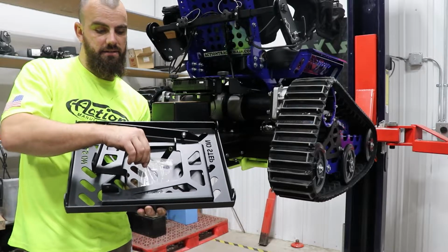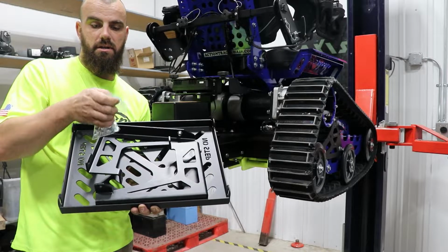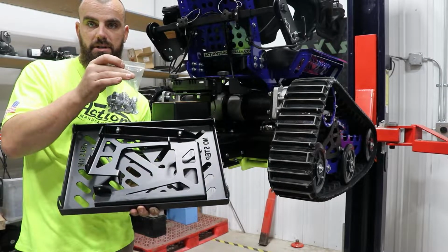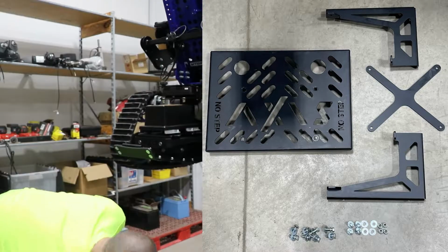Every single Axis comes with a rear rack. You'll get a hardware bag and these 4 parts. I'll lay this out so you can see what hardware is supposed to be in the bag, and then we will show you a picture of these parts laid out and then step through how to assemble this.